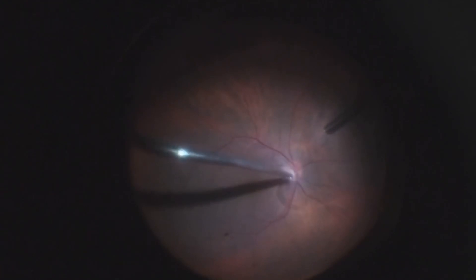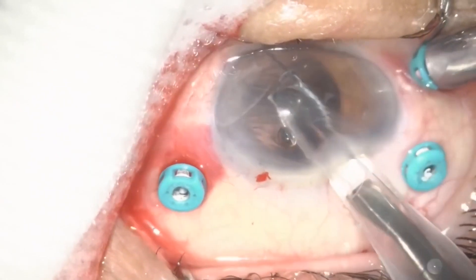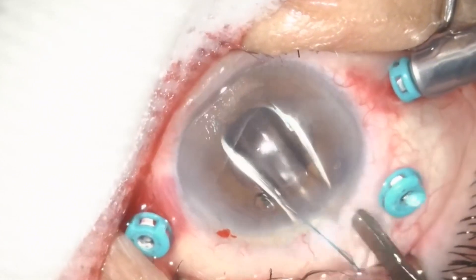It is important to review the vitreous base to remove all fragments and to treat any eventual retinal break. In the end, if the anterior capsule support is intact, you can place a three-piece IOL in the sulcus.